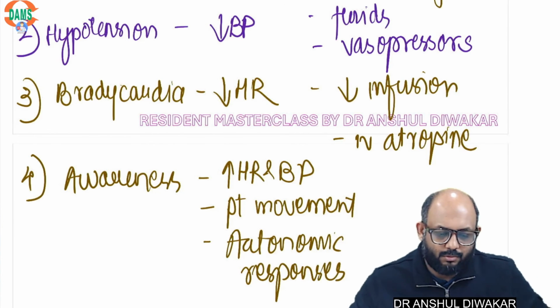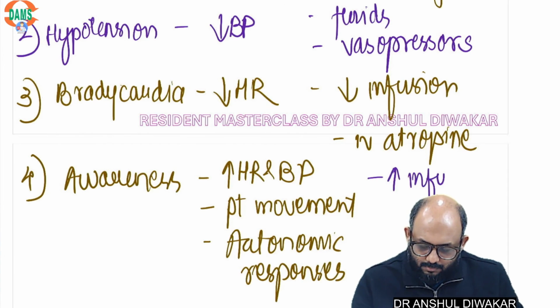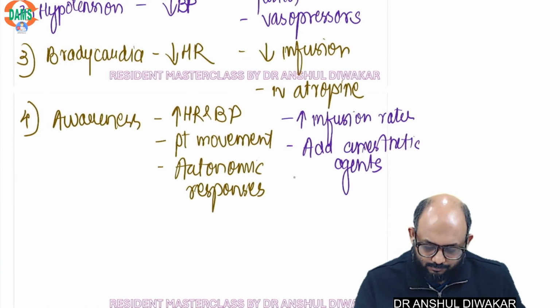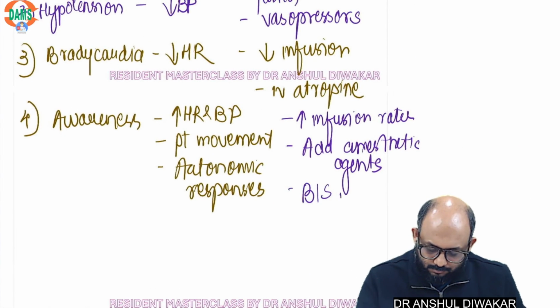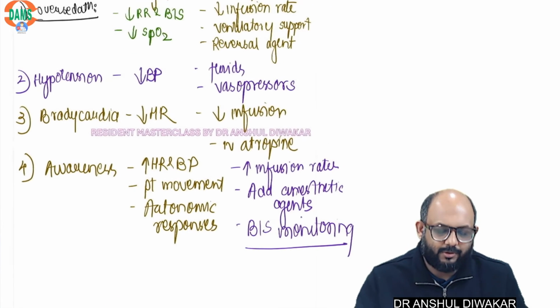So what you will do? You will increase the infusion rates. You will add anesthetic agent. And you will do BIS monitoring.